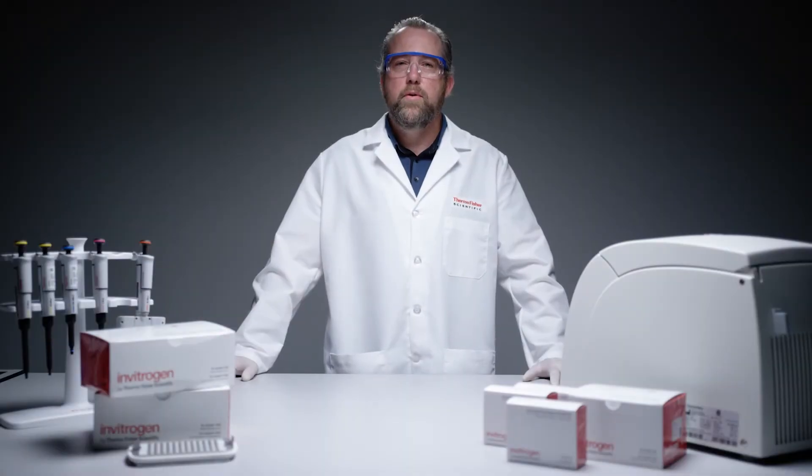In this video, we will walk you through the reagent preparation steps for Invitrogen ProCartaPlex Multiplex Immunoassay for convenience and mix and match panels.